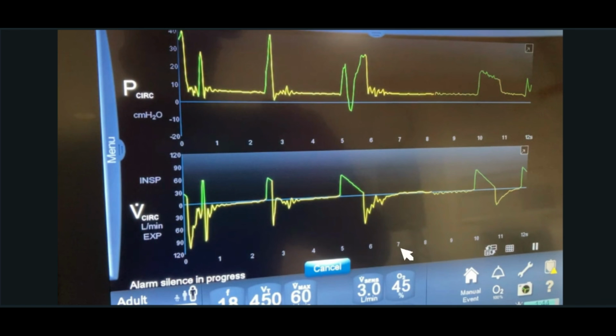Typically the ones at the beginning of exhalation, if there are oscillations up there and they're large, that's going to be closer to the upper airway, maybe bouncing around the bottom of the tube. Sometimes you have smaller ones toward the end of exhalation, and those would be some smaller airway secretions. These are all the way through because there were a lot of them, and you can see it also affects the pressure waveform as well. On the flow over time scalar before that, it was so much that it messed the flow up on the inspiratory side as well. So I'll go ahead and play the video for you now.